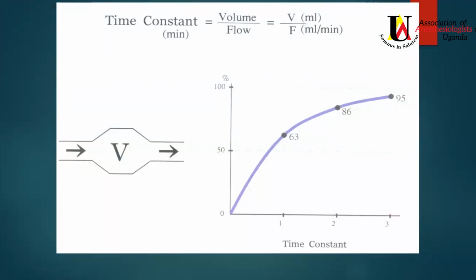So you find when you're running low flow anesthesia, you may have to switch off the vaporizer quite a bit earlier than when you are running normal flows.